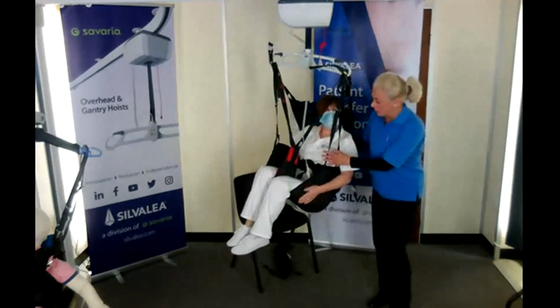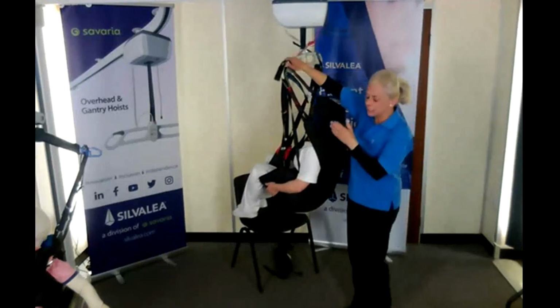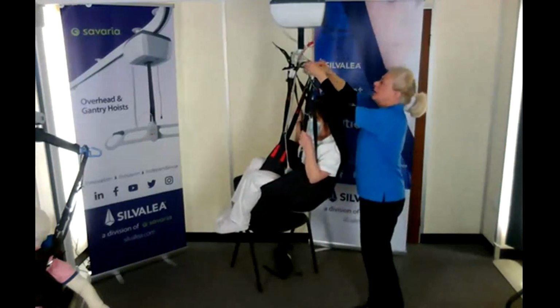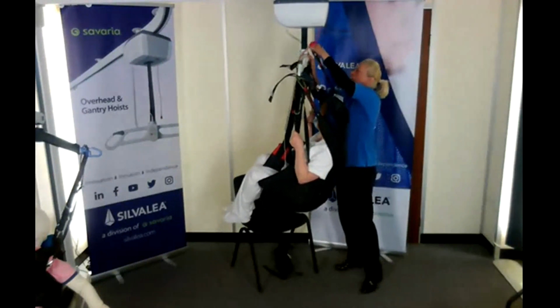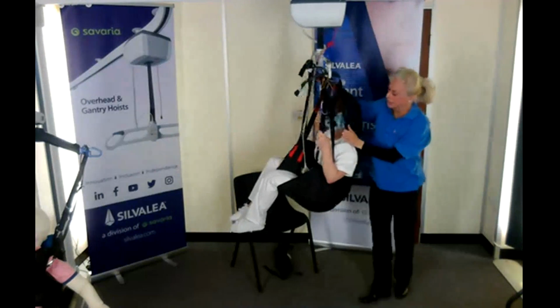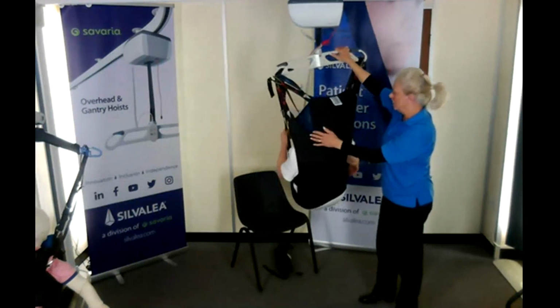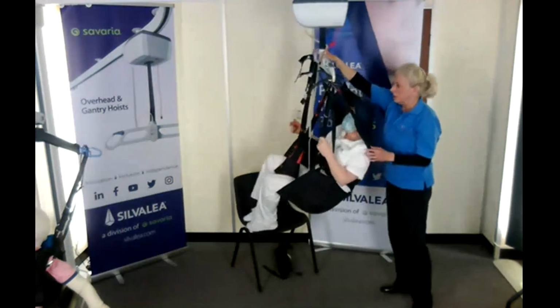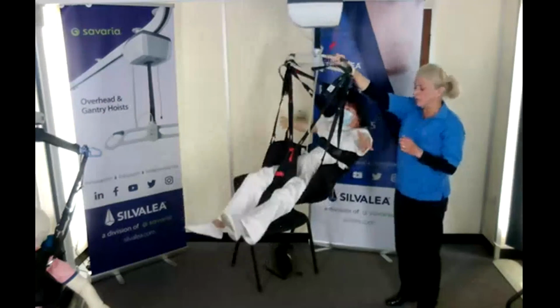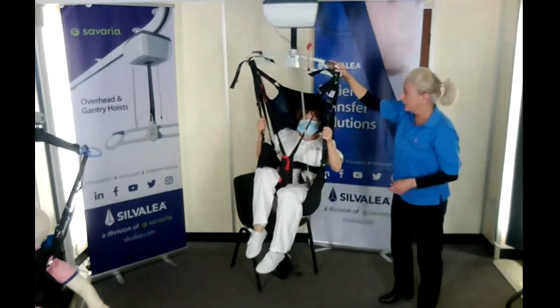So thinking about keeping the hips flexed and the head support tapes, you know, we can lock that head really tightly forward if needed, but we've got several options. I'm just going to put it on the yellow for the moment. And the head has got a little pocket here. So if Judith tries to escape out the side here, this side, then we can see. So it can be active, regular twists, you know, you've got lots of support from that sling.